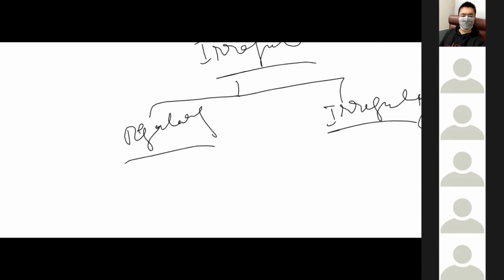You take an ECG and count the QRS complexes in 50 big squares, and the number of complexes present in between those 50 big squares, you multiply it with 6, then it gives you a rough idea of the rate.